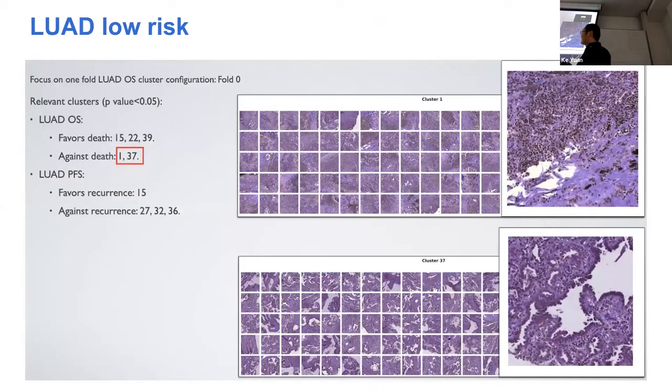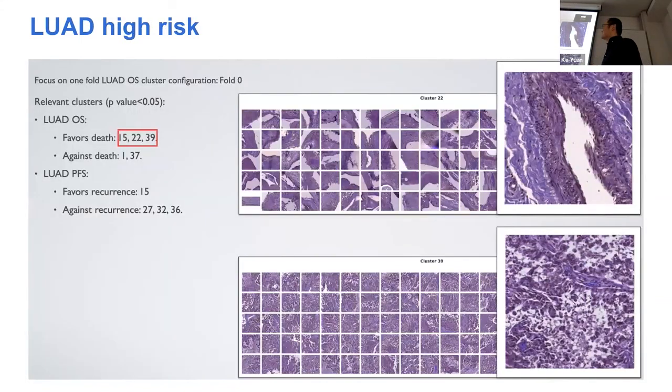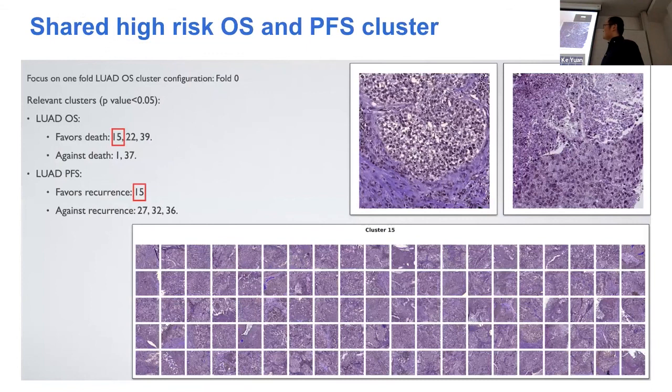So here, I'm not going to do details. These are part of the visual inspection. We have our pathologist collaborator looking through those images and helping us understand what they mean. What we find here is that in addition to the TCGA overall survival test, we look at an independent cohort from New York University, and then we ask the question about progression-free survival.